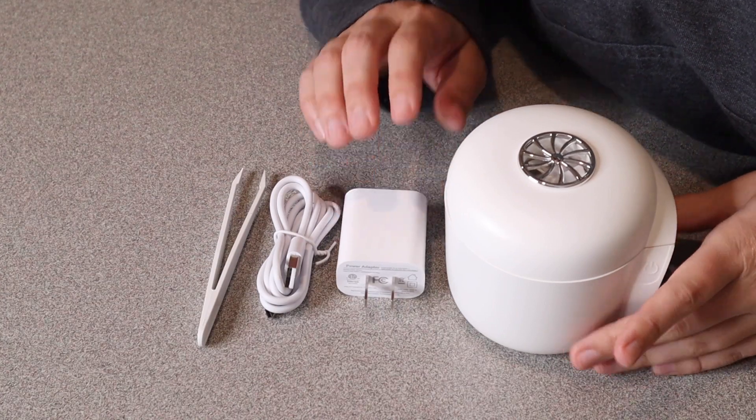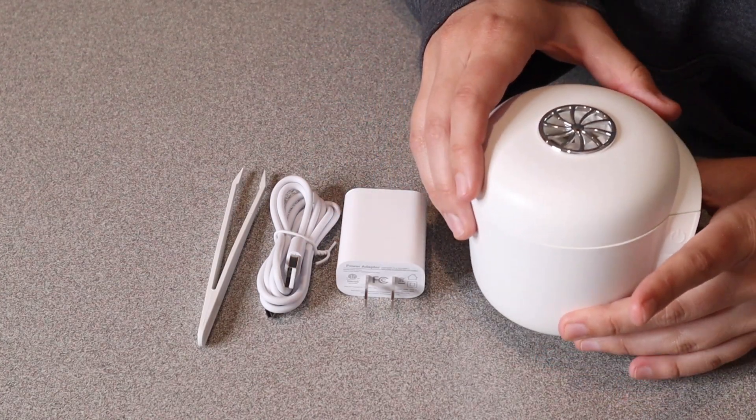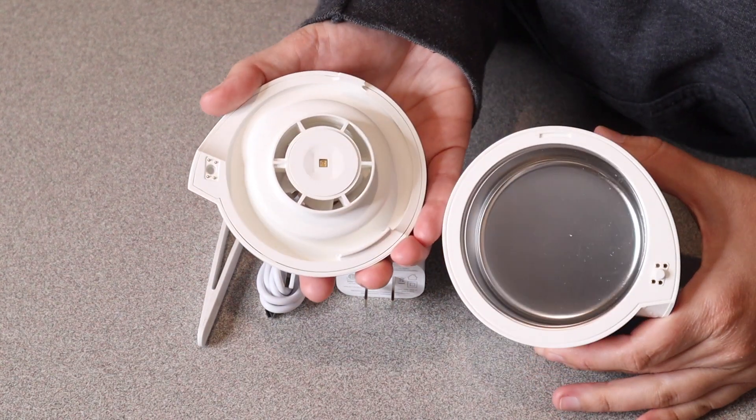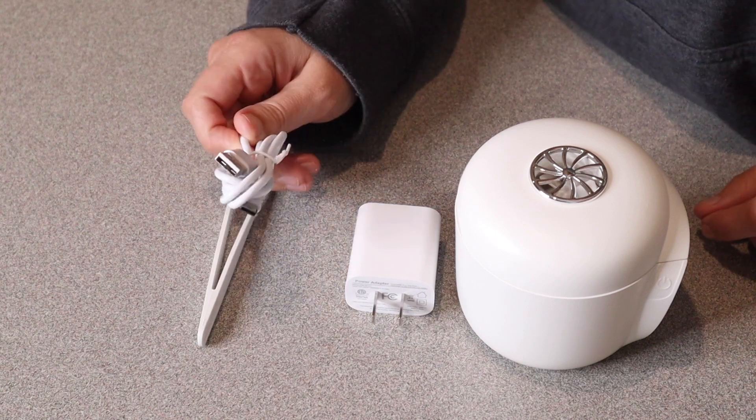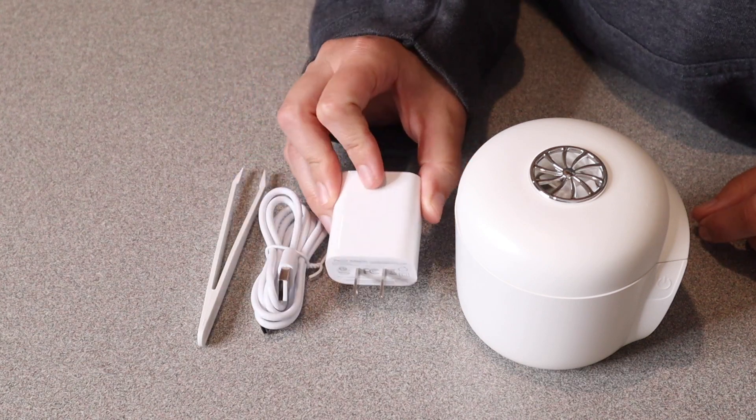Right here I have this ultrasonic cleaner with air drying. I'm going to open this up and show you everything it comes with. This is everything that comes inside the box besides the user manual. We have the actual ultrasonic cleaner itself right here. You can see you could just take off the lid and see inside. It comes with a wall plug-in — a USB to type-C cord with a little wall plug-in as well.